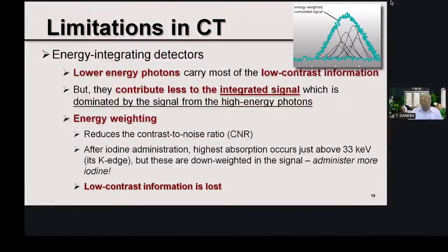So for that, low energy photons are important because only they can differentiate between the soft tissues. But these low energy photons, as you can see here, contribute less to the integrated signal, which is dominated by the signal from the high energy photons. Look at these high energy photons, they dominate.